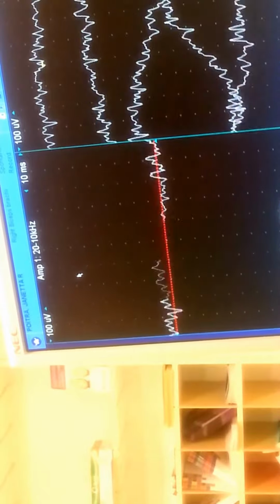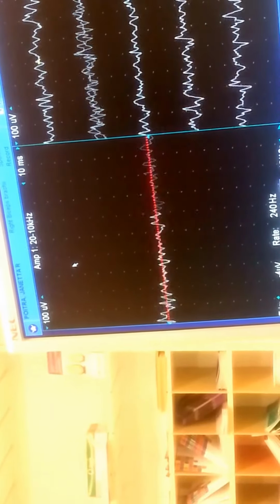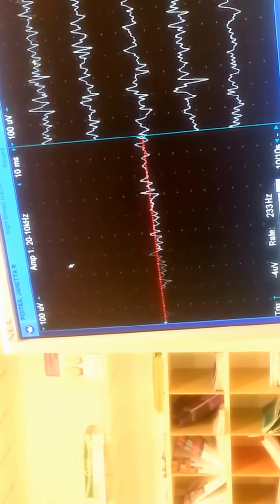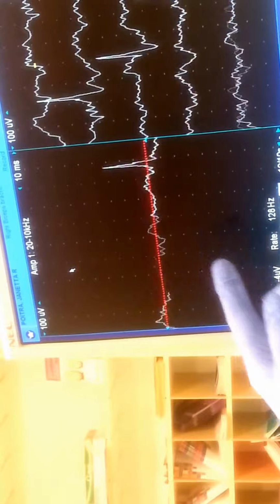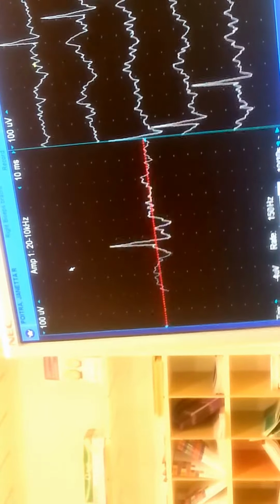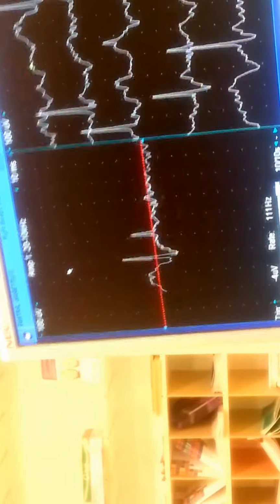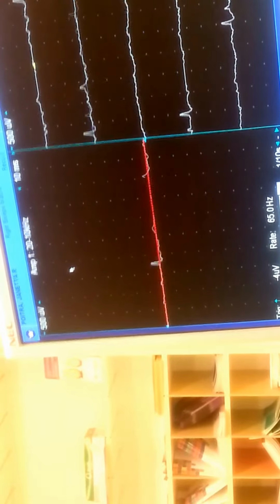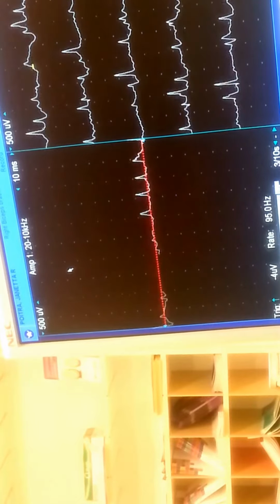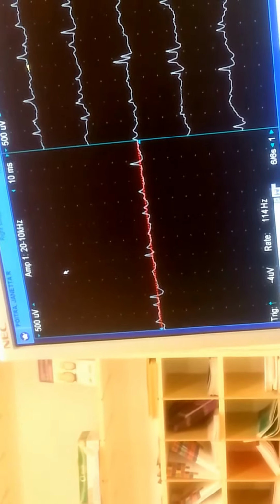So burst quiet, burst quiet, burst quiet. Now, slowly bend your elbow. Not a lot, just a little bit. There you go. See how you're firing your motor units? See how sharp and skinny? That's what you pull towards you a little bit more. See they get faster and bigger? Pull again. Good, nice. Okay, so that was C5, 6 are looking good.